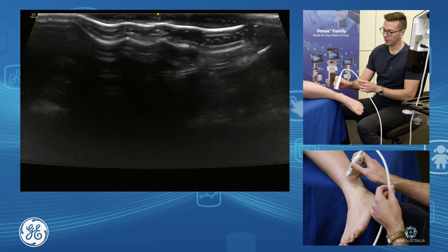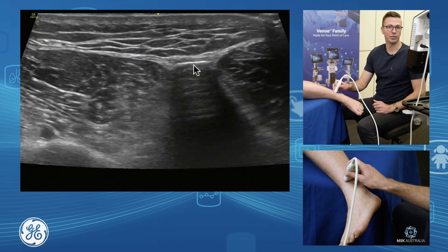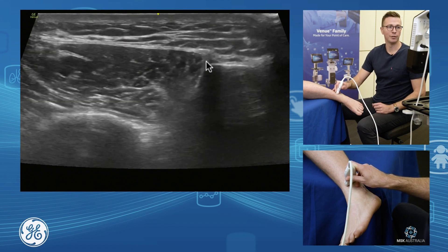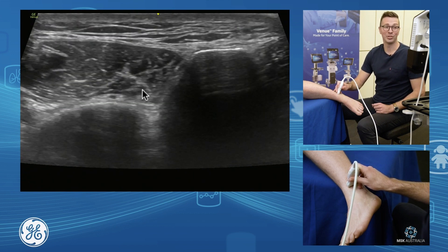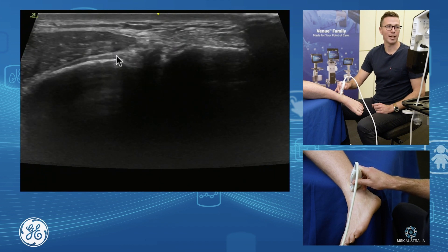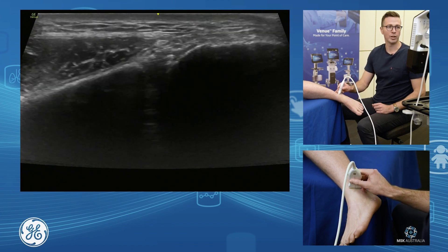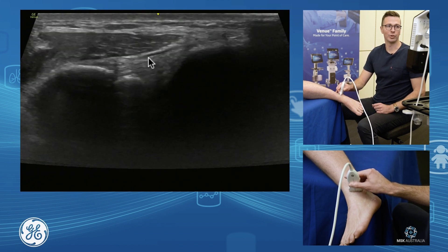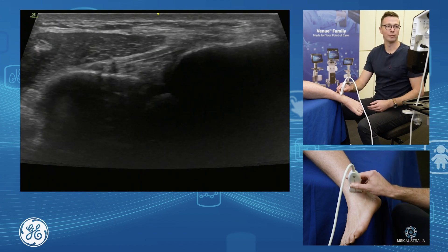The other way to locate it is to grab your probe in short axis at the distal part of the shin, find your fibula, find your tibia and come down - drifting inferiorly to get to the very end of your tibia - then rotate your probe up and around to elongate on that bit of collagen which is your anterior inferior tibiofibular ligament. You'll see your probe sits up quite high with the orientation of those fibres.